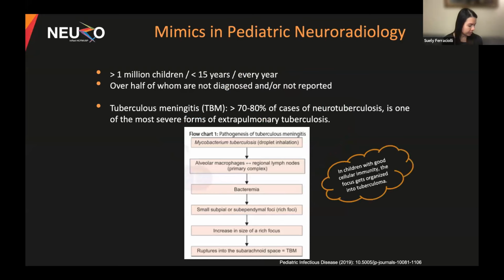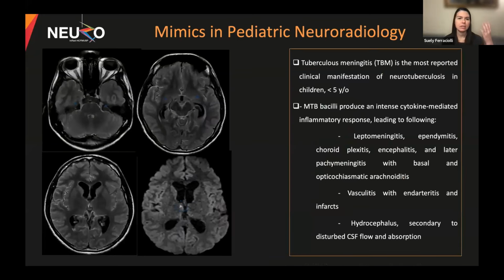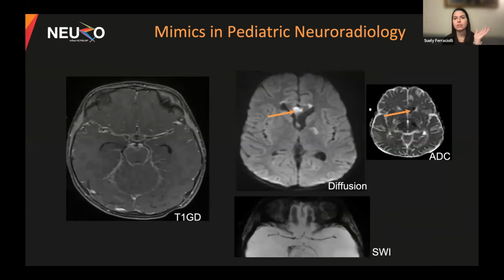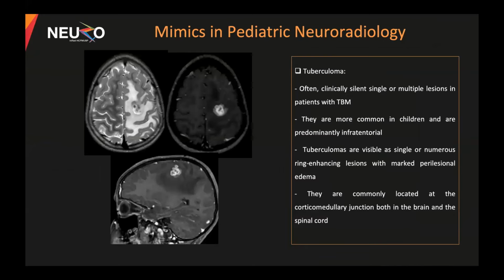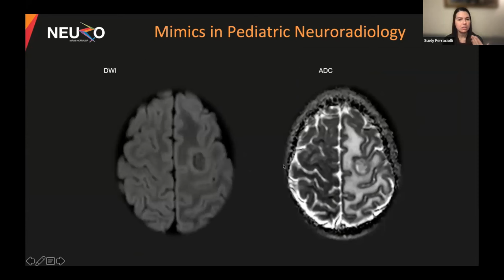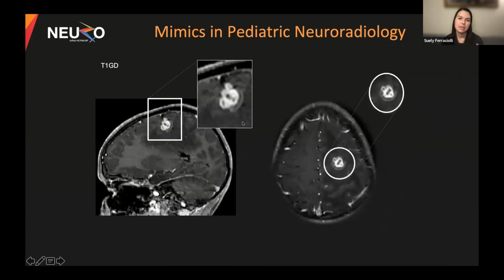I think I'm gonna skip to just say that you have meningitis. This is the typical form with hydrocephalus and with the ischemia. You can also have the tuberculoma, and this one is the tricky one because you may make the differential diagnosis with neoplastic forms, and sometimes they do biopsy this thing without the need for that. So you may help the clinicians to think, no, this is not restricted. It has this lobulated appearance.